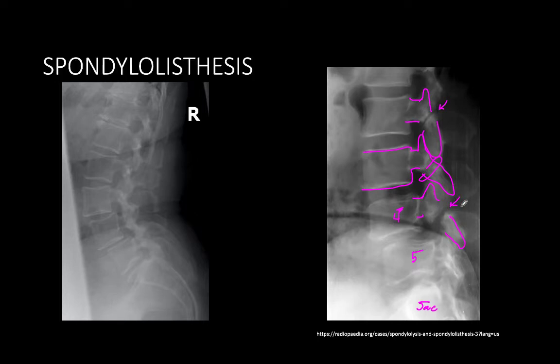Realize that you don't always need lateral obliques to see spondylolysis. Okay. Again, these typically happen in young adults who are very active, hyperextend. You'll notice these spondylolyses are very smooth and very regular. These are old. These are not new pars defects. These are not active stress fractures. And if you're not sure, MRI is the best way to go.